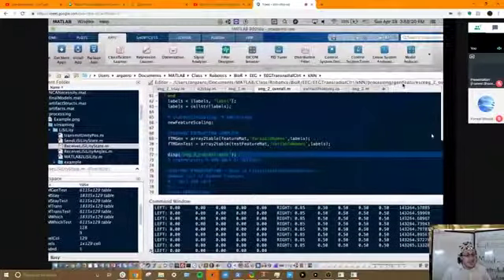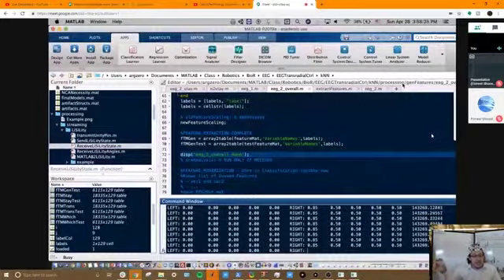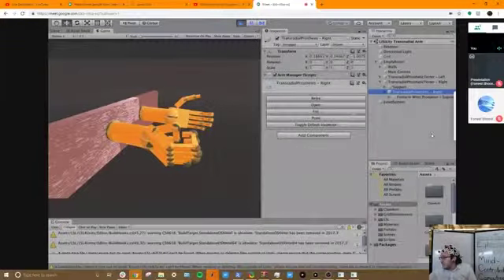So on each of the fingers, it's taking that data and giving it to the prosthesis, and then the prosthesis on both ends is sending all of the data to one system that sends all of the data for this entire simulation. And so that's how this whole simulator system works.